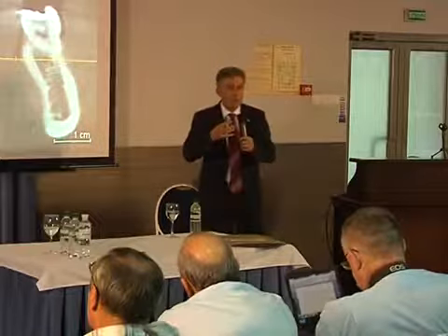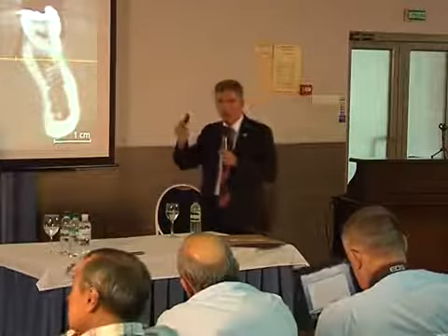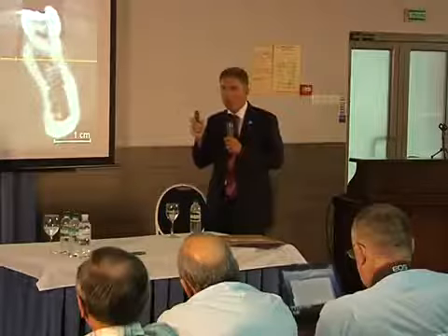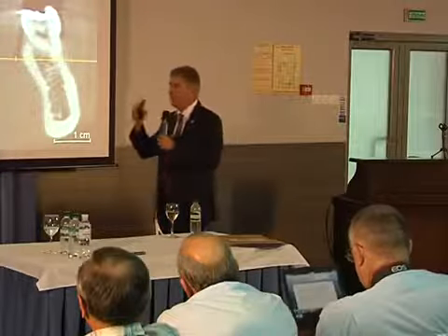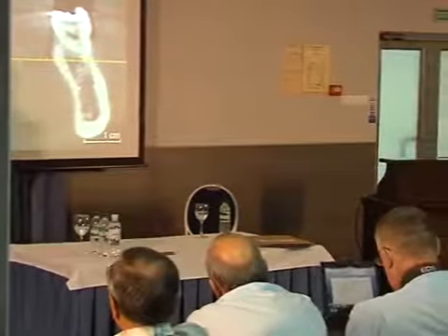So the solution in this case, before the era of piezoelectric surgery, before the tissue-friendly technique of PRGF, was just to put a block.